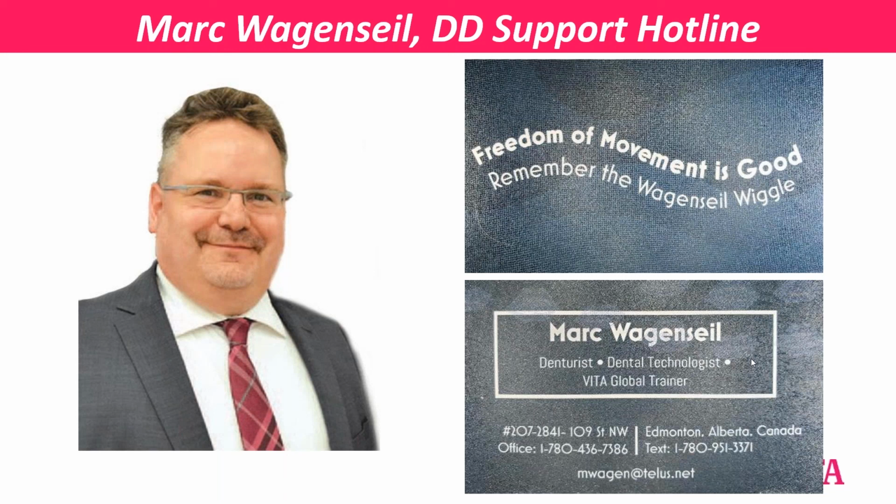I always want a first molar and a second molar, if at all possible, because they're wider and there's more surface to bring the food up to get crushed than what's on a second premolar. So if you're going to drop a tooth, I always drop the second premolar in favor of a molar first and second. If size permits.